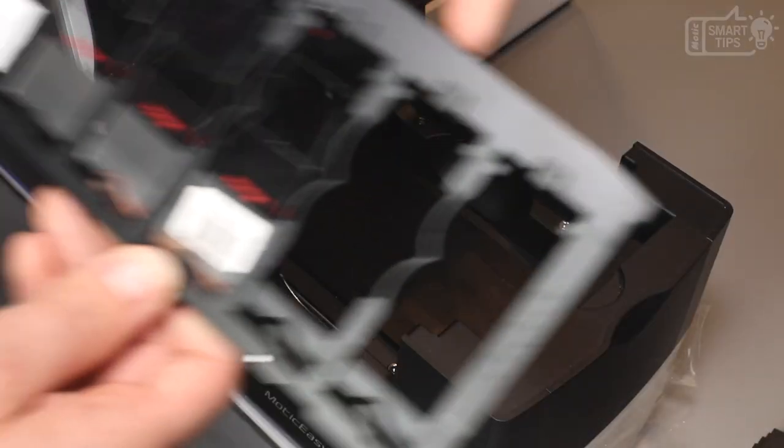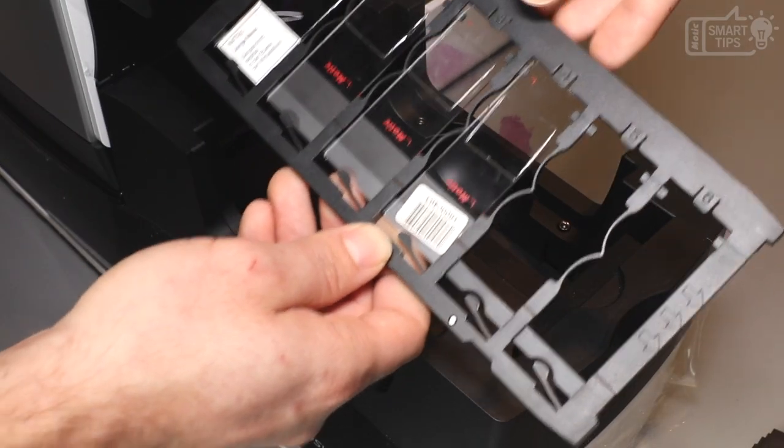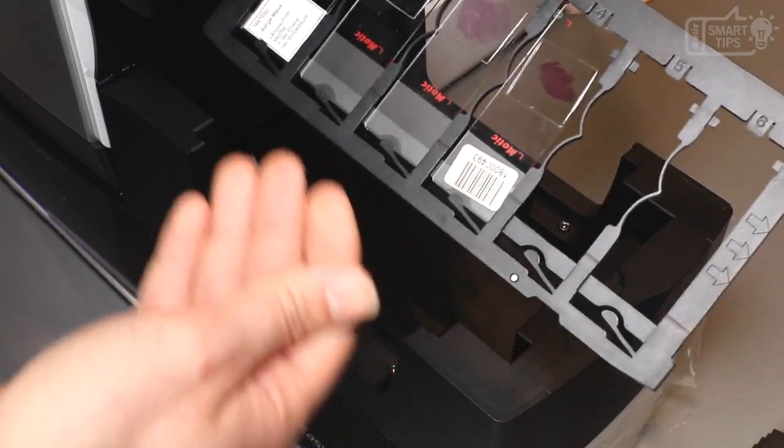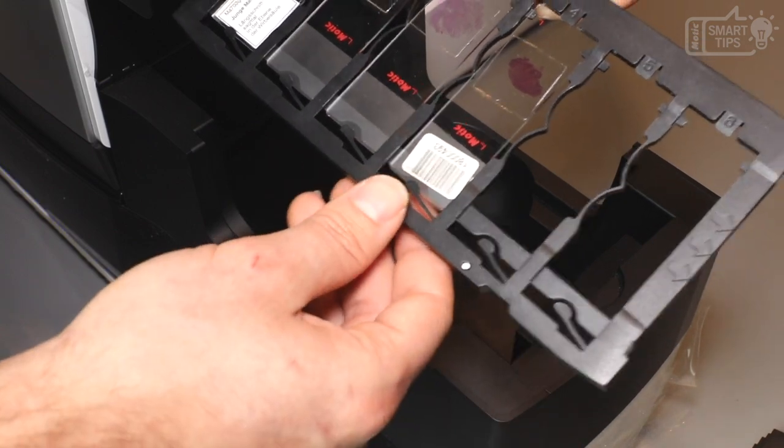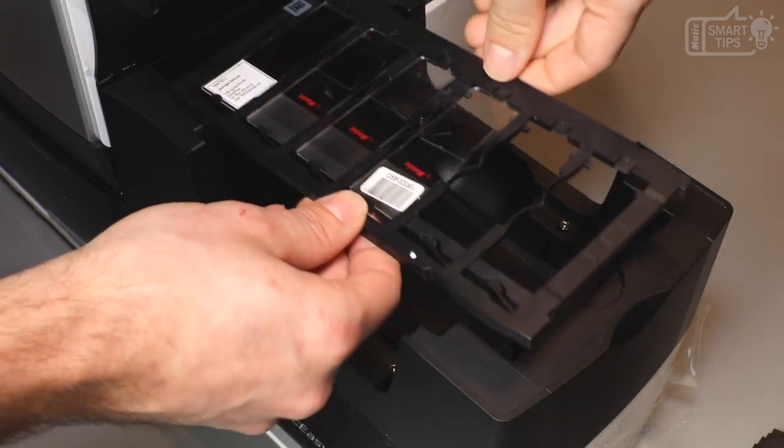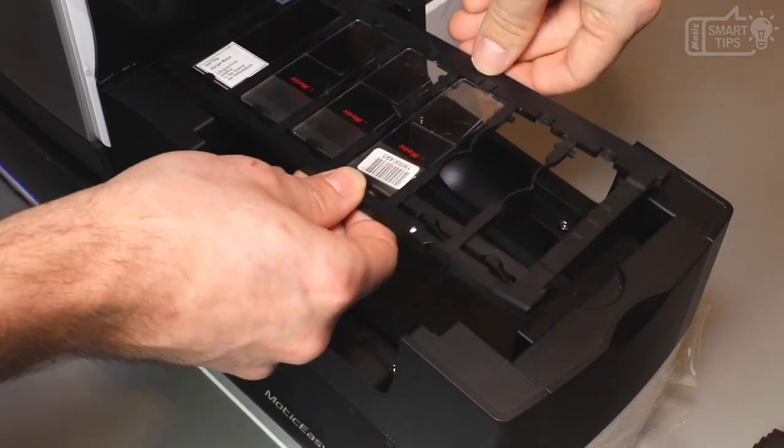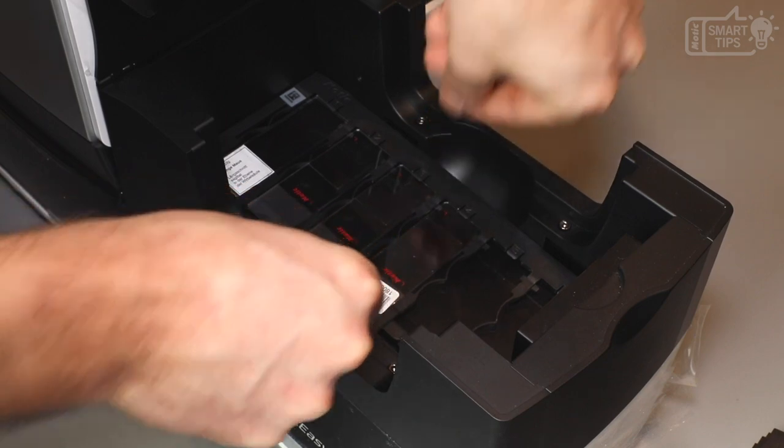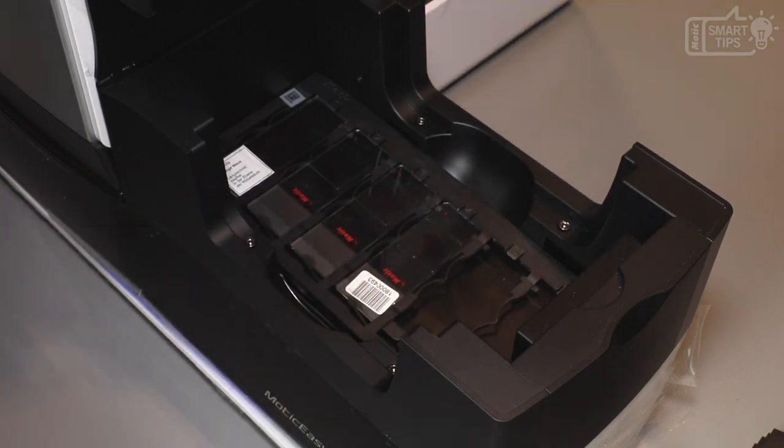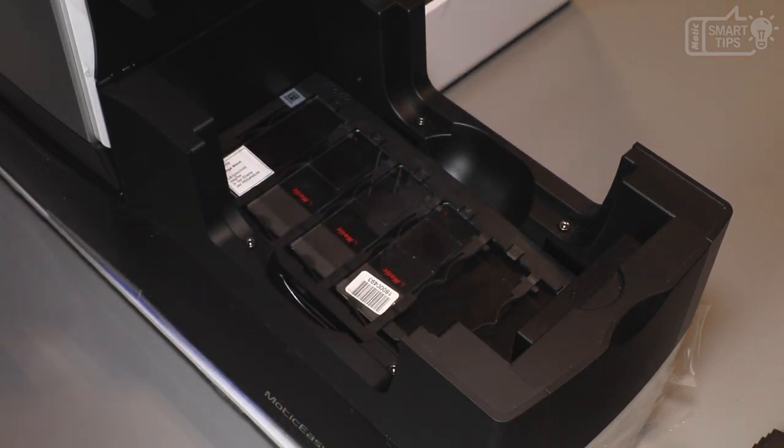Okay, so once you're ready to start the scanning process you just need to put the slide into the right side of the scanner, just like this. And now you can go to the computer and start with the scanning.